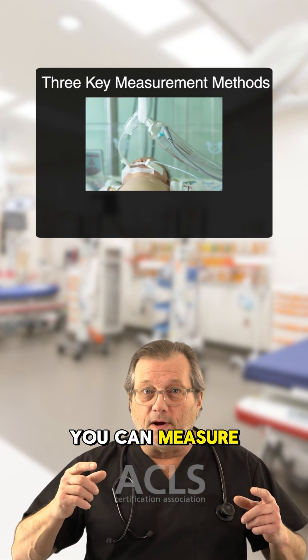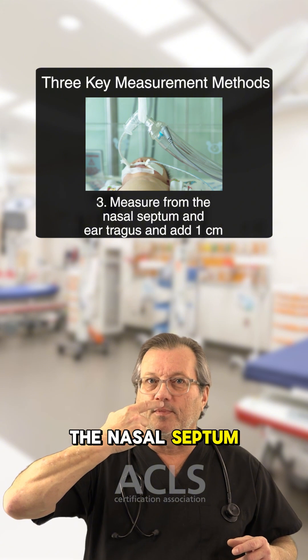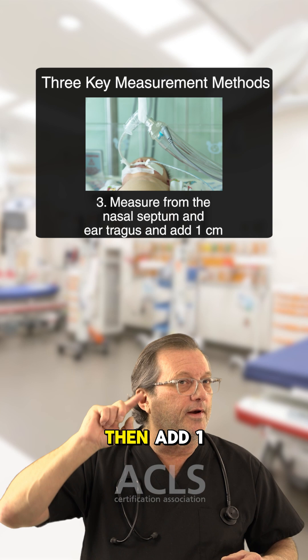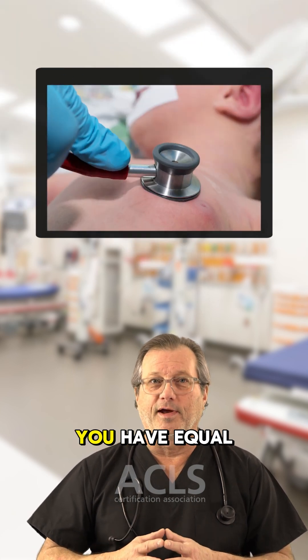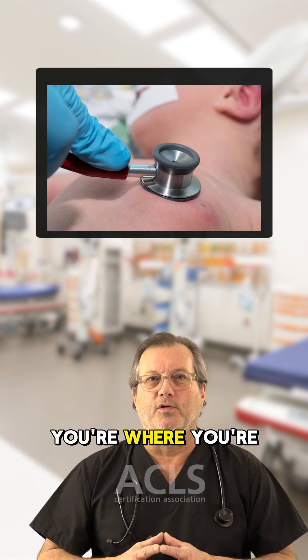Another method: measure from the middle nasal septum, come around to the tragus of the ear, and add one centimeter — that's about where your markings should be also. So those are three quick methods. Make sure you have equal lung sounds and all the other parameters look good to confirm you're where you're supposed to be.